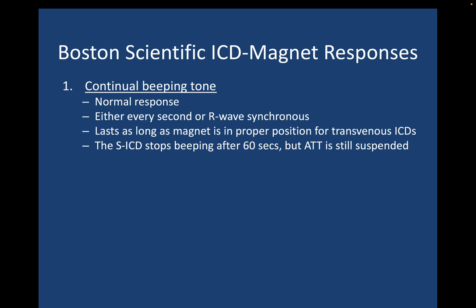Boston Scientific ICDs, the typical response, the normal response, will be a beeping tone that's either every second or R-wave synchronous that lasts as long as the magnet is in proper position for transvenous ICDs. If you put a magnet on the Boston Scientific S-ICD, the beeping will actually stop after 60 seconds, but the anti-tachytherapy continues to be suspended as long as you haven't moved the magnet.